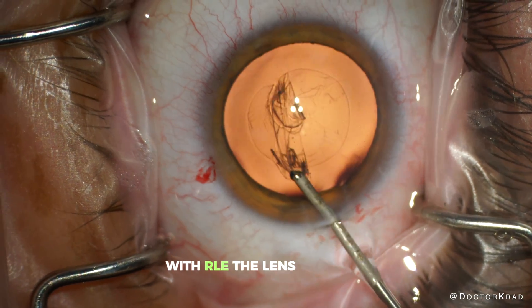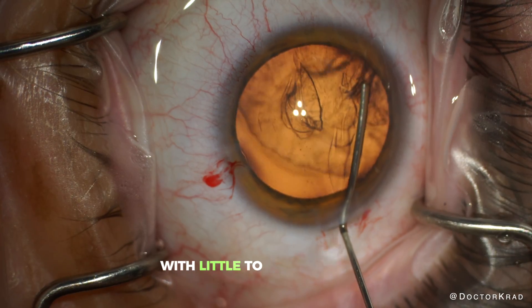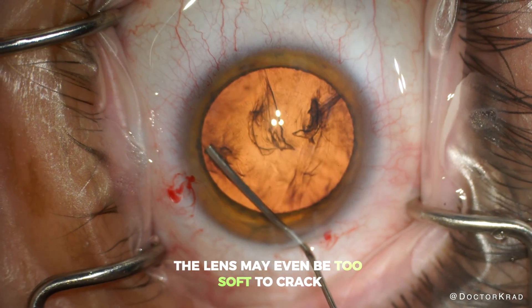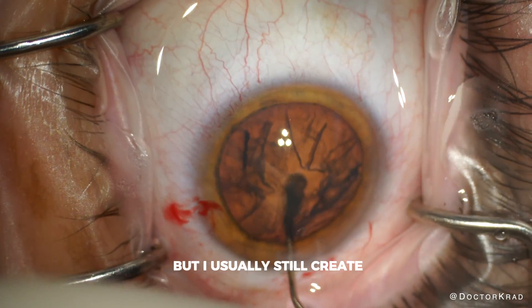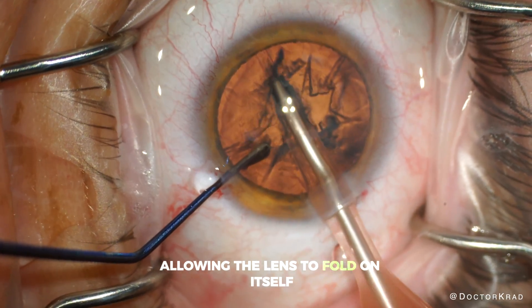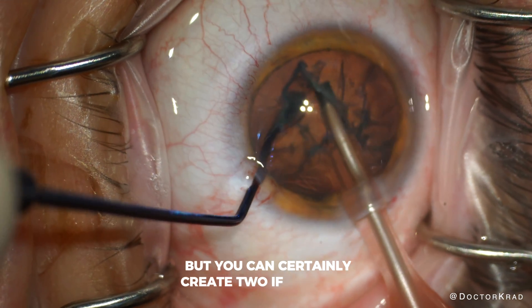With RLE, the lens can be so soft that it can be aspirated with little to no ultrasound energy. The lens may even be too soft to crack, but I usually still create grooves, since the grooves provide space allowing the lens to fold on itself. One groove is sufficient, but you can certainly create two if you want.